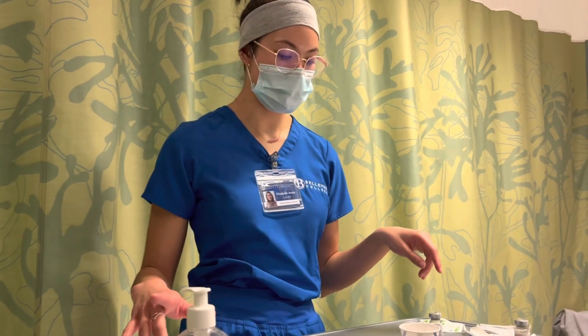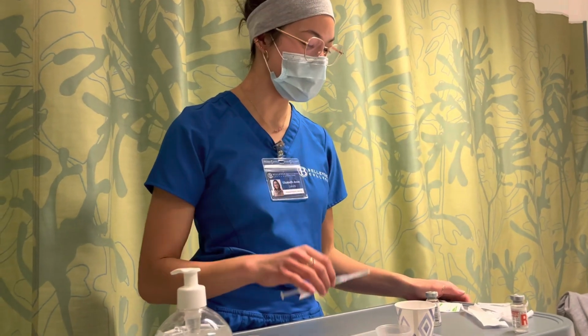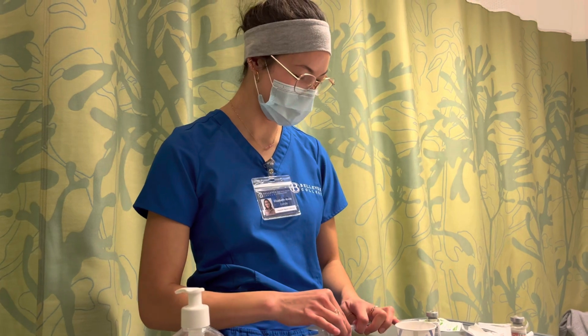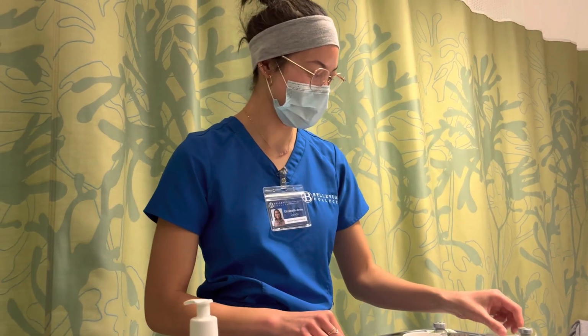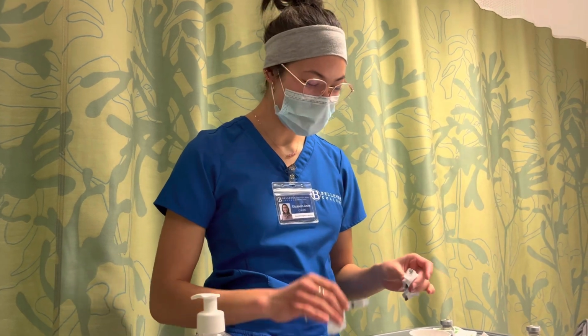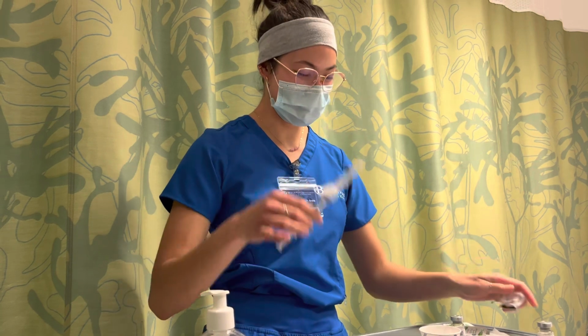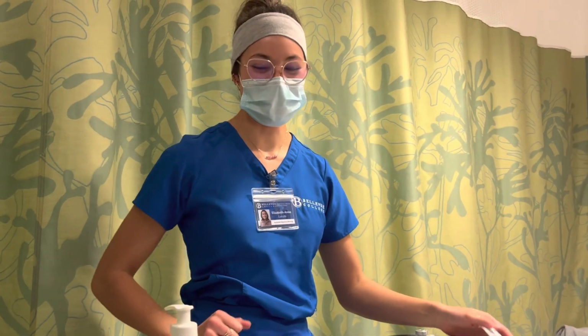Also, prolonged use of this antibiotic could cause super infections. Before we go into our patient's room, I am going to change out my blunt needle. Now we're ready to go into our patient's room.